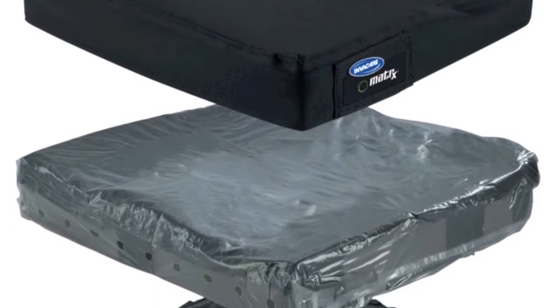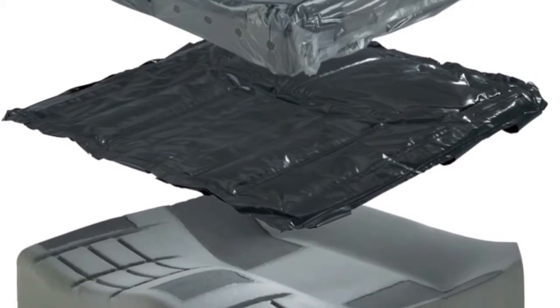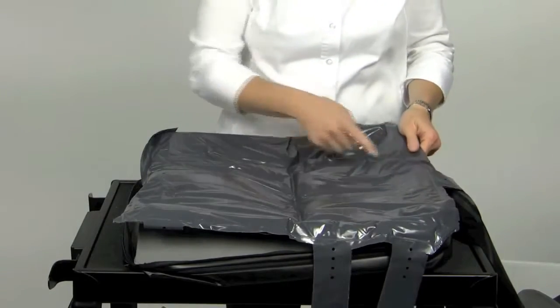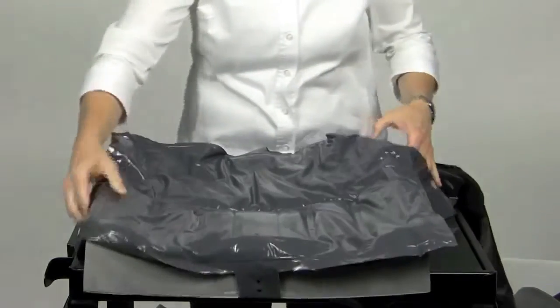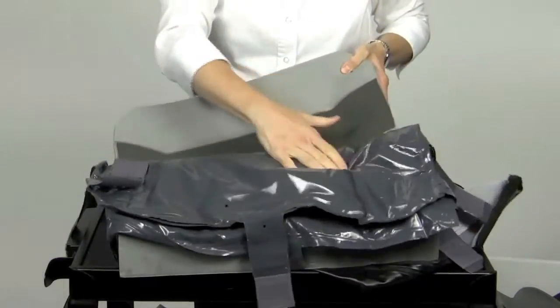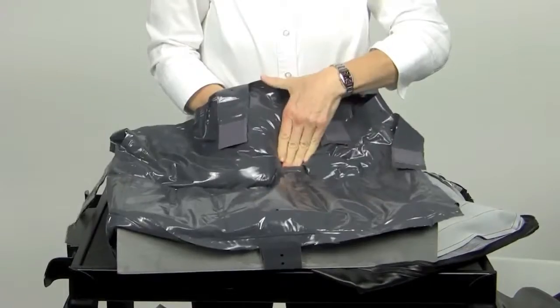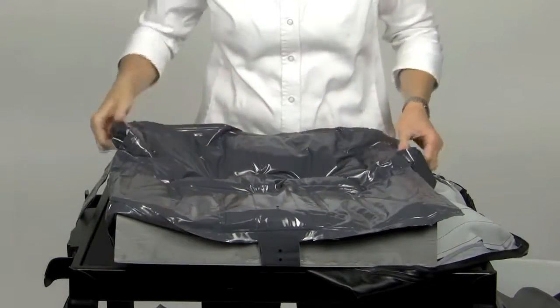The Flowtech Cushion on E2622 and E2623 is an adjustable skin protection cushion which features a unique dual layer fluid overlay design. The cushion has dual level fluid compartments. The bottom level is one continuous compartment to allow full immersion and accommodation to the pelvis. The top compartment is sectioned into two sides to help keep the fluid underneath the ischial tuberosities.